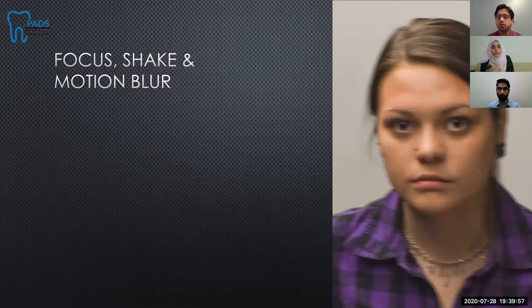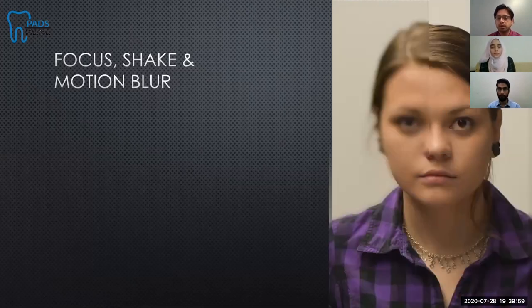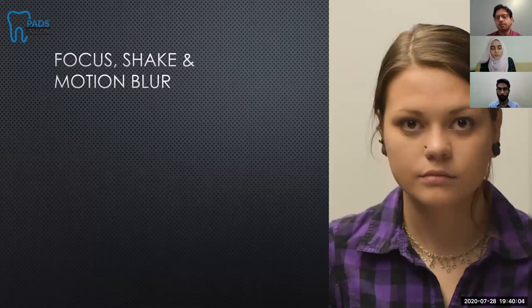And only when you know the difference between these two, my dear friends, just look at them again. And when you're taking a photograph, it's a small LCD. You really need to train your eye to see if it is in focus or not. And then if you can detect it, you really take the photograph.